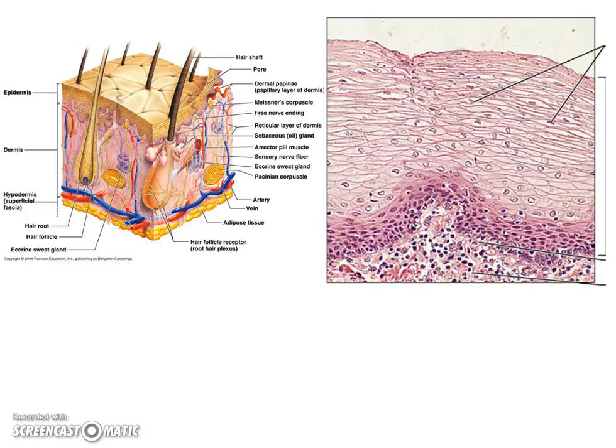So what I want you to do now is go back through and look at all of my picture examples again, turn your paper over on the back and make an artist drawing from the micrograph or the microscope slide that's on each one of my slides. Fill that in. They should be the same color. Notice that they're usually either pink or purple or dark blue. Those are the 3 colors you're going to use, except for bone, which is kind of brown in color. So I want you to color them as you would see under the microscope, and on the lab practical I will have these same pictures, and you'll have to tell me what kind of tissue it is.